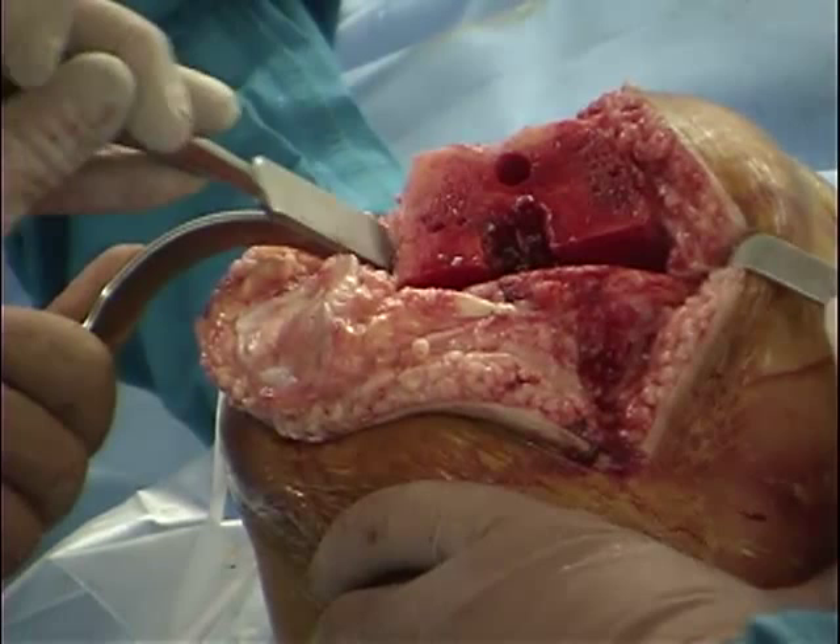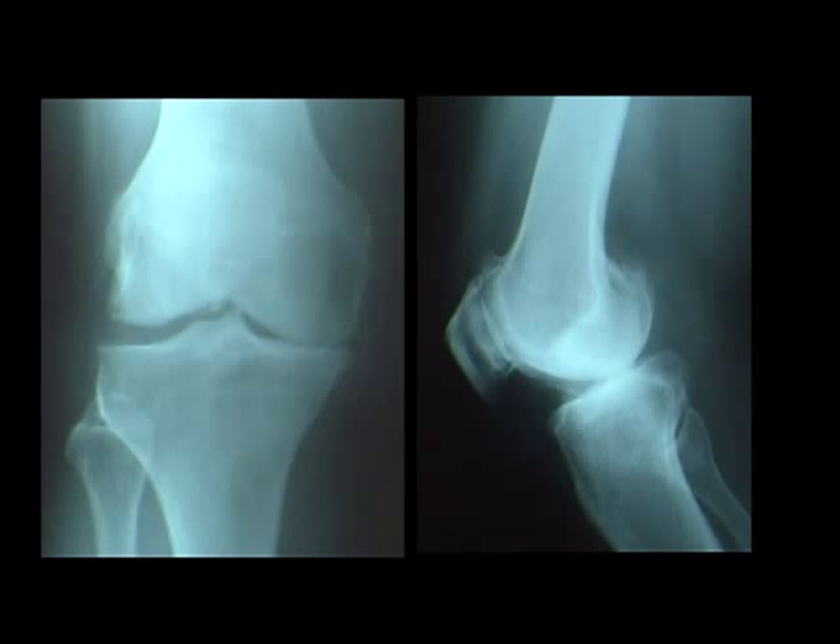The case demonstrated in this video is that of a varus osteoarthritis of the knee requiring typical releases off the medial aspect of the patient's tibia.